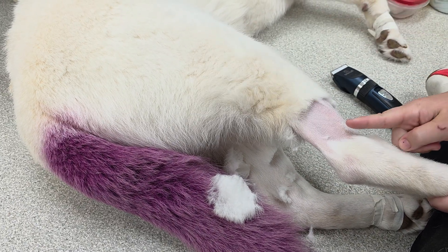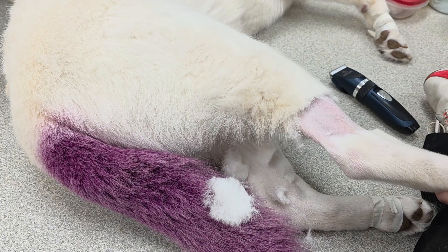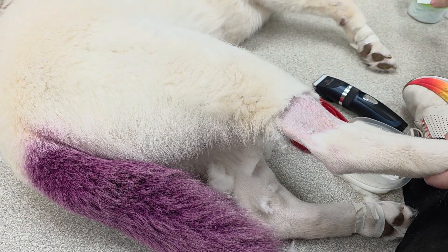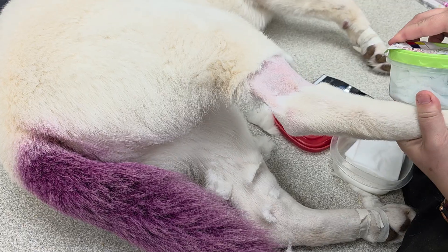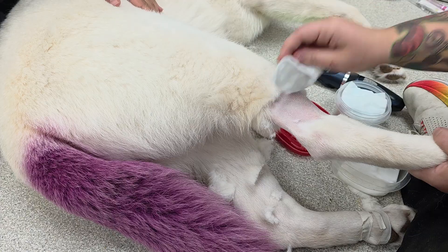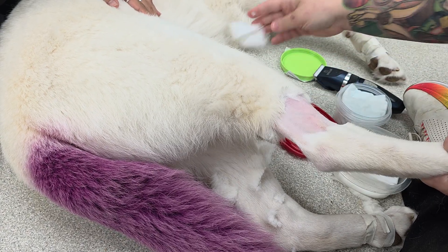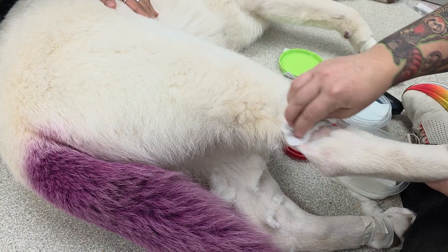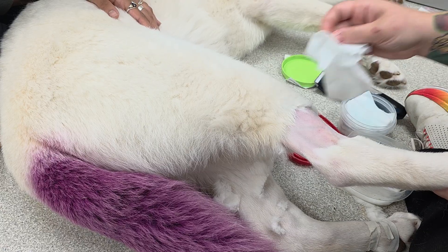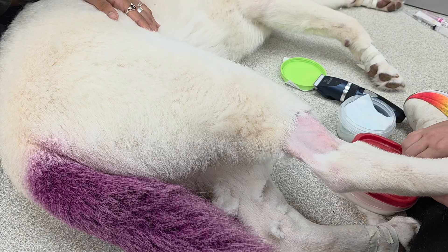As we talked about in our earlier videos, the vein runs there and then wraps around. Now we're going to prep our site — we're going to scrub. All right, so we have prepped it.